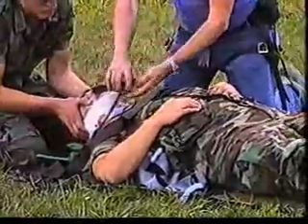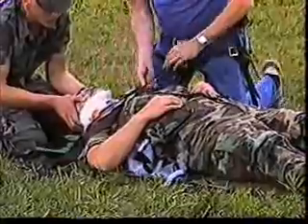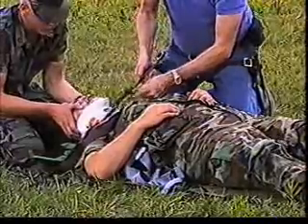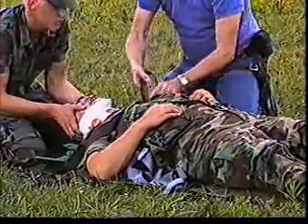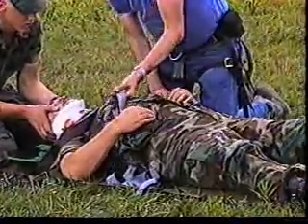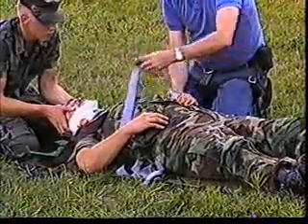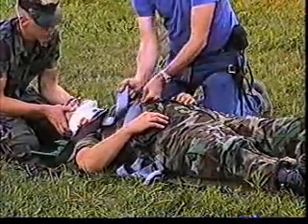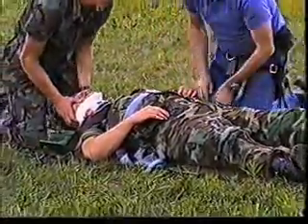Go to the green strap. Make sure you hear the click. Once again, we're going to be a little short, so okay. Feed this in there so we don't torque his spine, okay? Go to the upper body strap. They have a white buckle, so you're not going to have any difficulty. I'm going to move your cigarette pack up a little bit higher there. Okay, once again, feed the strap in there so we don't torque his spine. If you go jerking like that, what's going to happen to his spine? Okay, go to the next one.